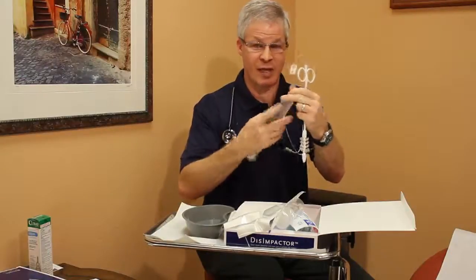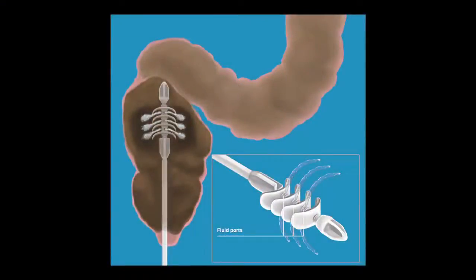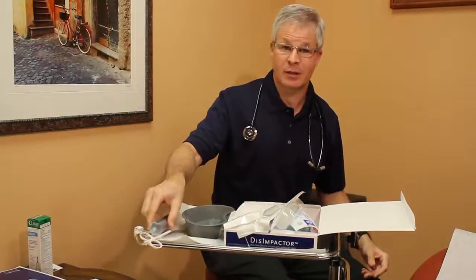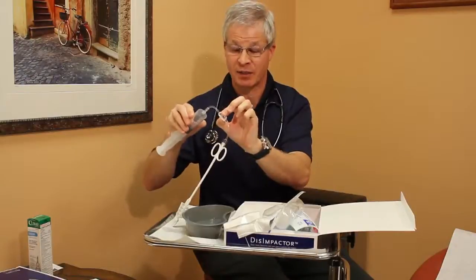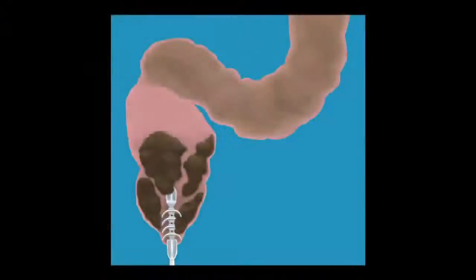So with the syringe now coupled, we can gently infuse our enema fluid, and you'll see that with gently pressing the device, the enema fluid is able to easily exit. So this will be obviously going into the fecal load, so you'll want to assure that the patient is comfortable during the procedure and tolerating it well with a nice, slow, gentle infusion. Once the fluid is in, you'll want to clip the lock that comes on the tubing, and that just prevents any backflow through the tubing. And you'll again withdraw the device and discard it after you've inspected it.